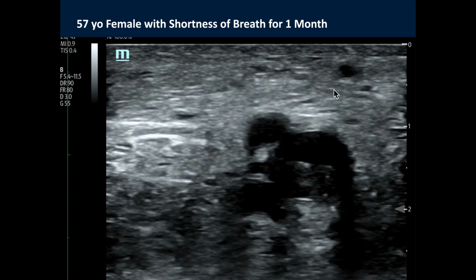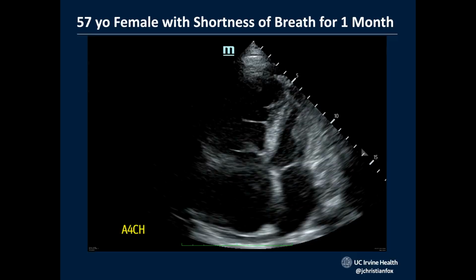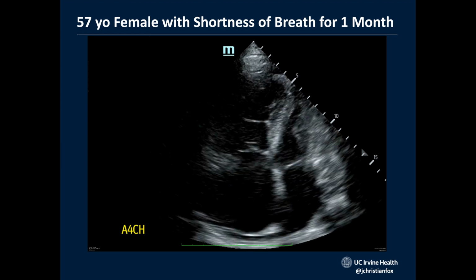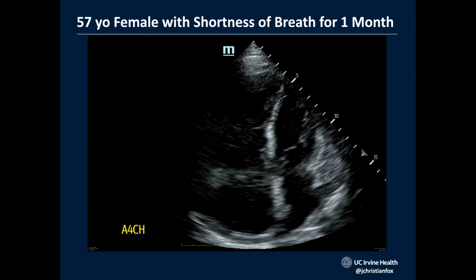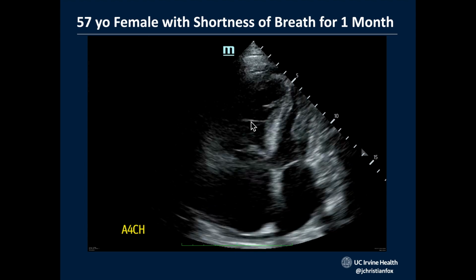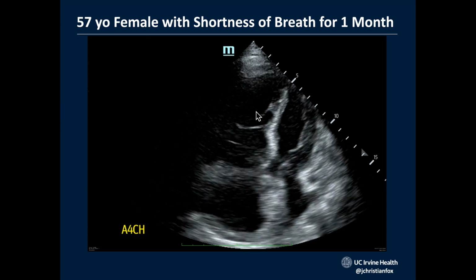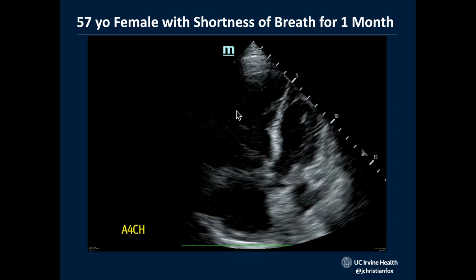However, with the shortness of breath, I start worrying about this patient having a blood clot to the lung. And so we go ahead and get an ultrasound of her heart. We do a point-of-care ultrasound. We put the probe in the apical 4-chamber view, and I'm expecting to see the left ventricle over here be larger than the right ventricle, but instead, in the setting of a pulmonary embolism, her right ventricle is actually pretty dilated, and it's been that way now for a month, and so it's had time to kind of dilate out like that.